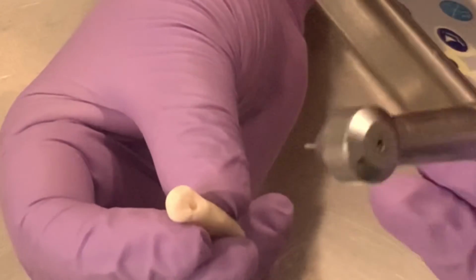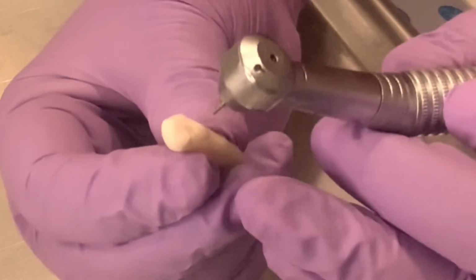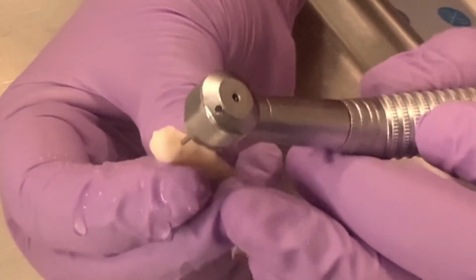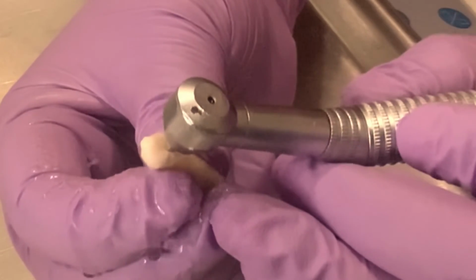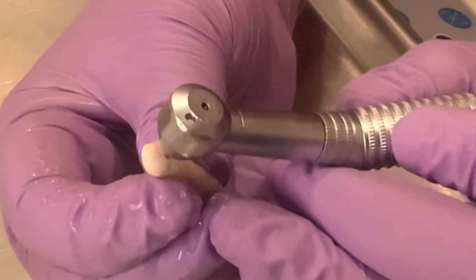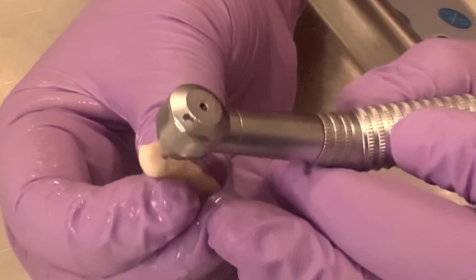With help of a straight burr, the overhanging enamel and dentine of the palatal roof of the pulp chamber are removed, including the pulp horns. The burr is used in sweeping out motion, and as the cutting proceeds, it will reveal an ovoid-shaped pulp chamber.